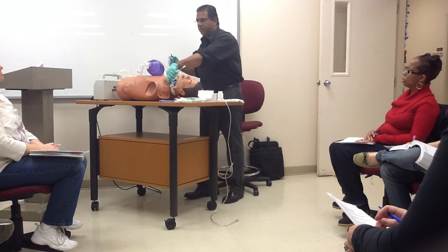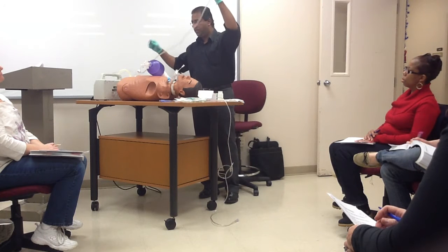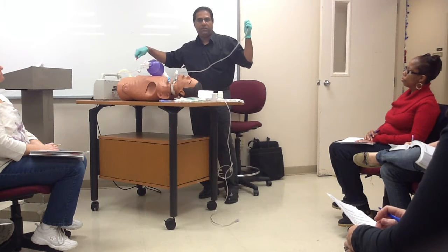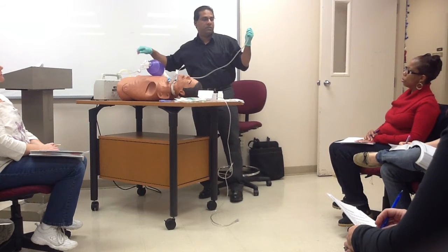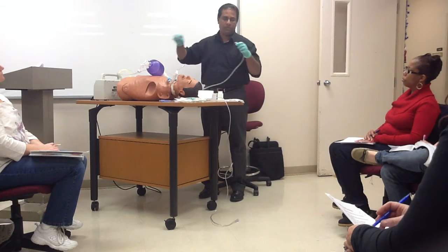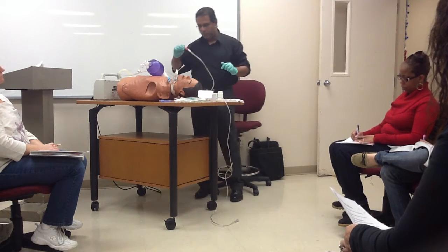Anything that I'm missing, let me know, okay? Your suction is already turned on, and it's all ready to go. And I showed you last week how to set up the suction. What should the suction pressure be? It's an adult. I have it on 100. Right. All right.